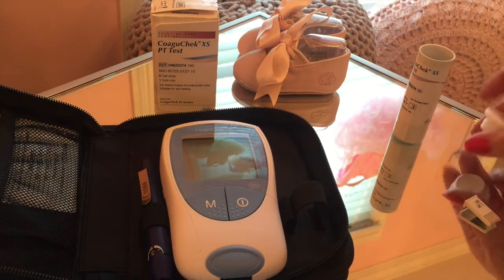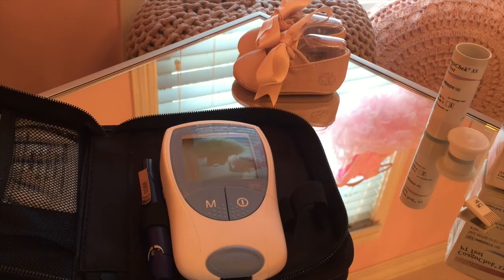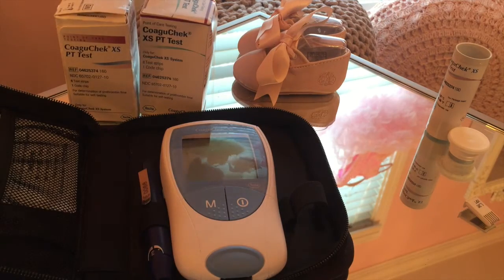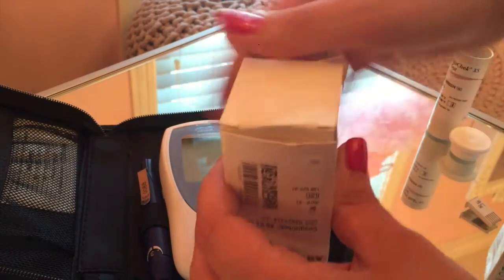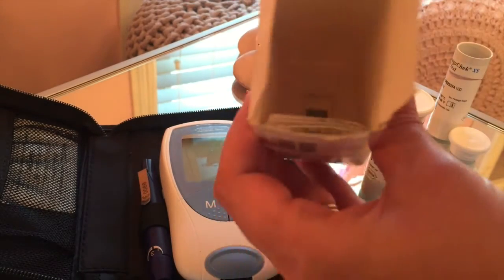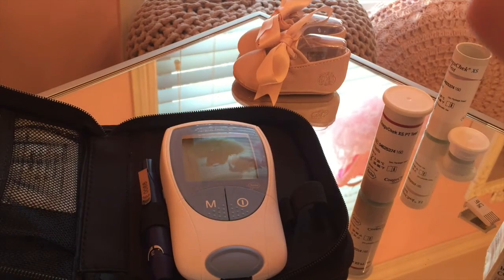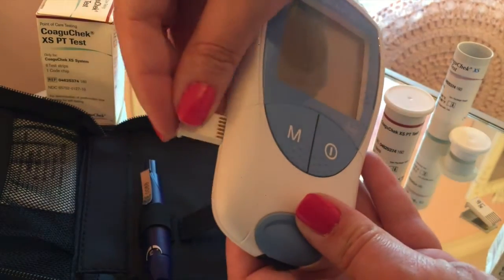You do need to order new strips. Every time you only have three strips left, you need to order a new set. The new box looks a little different — I wanted to show you both just in case. Inside the new box they have it sealed, and inside there is the capsule with your test strips. You're also going to find a new chip in there. That's the hardest thing to remember, really, and that's not hard. You just insert the chip into your machine.